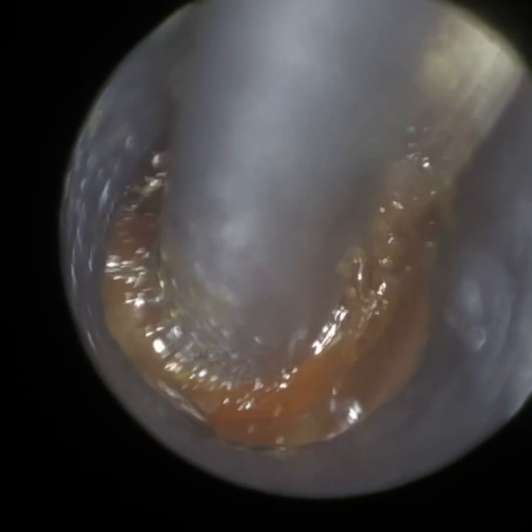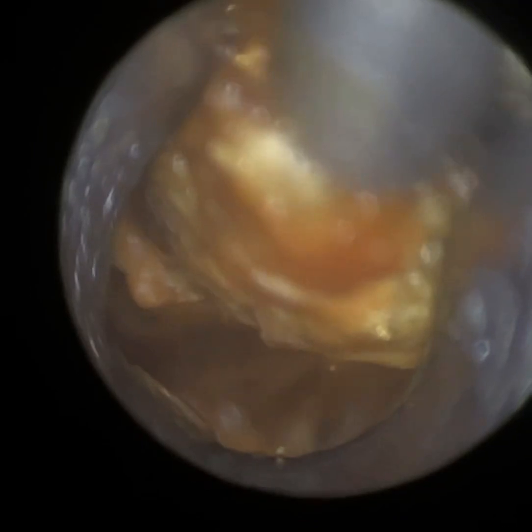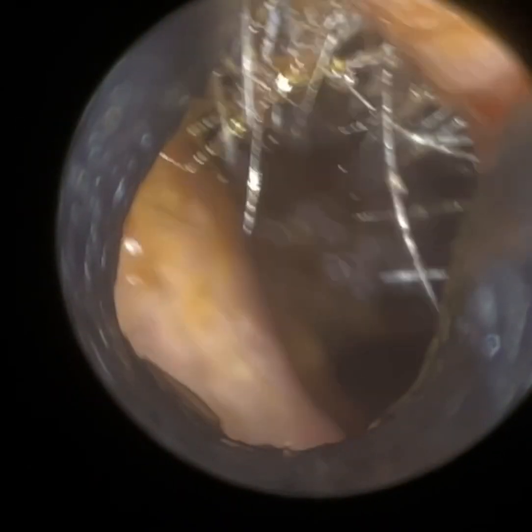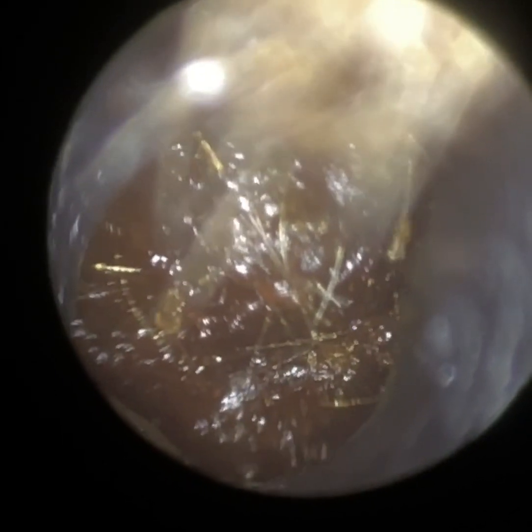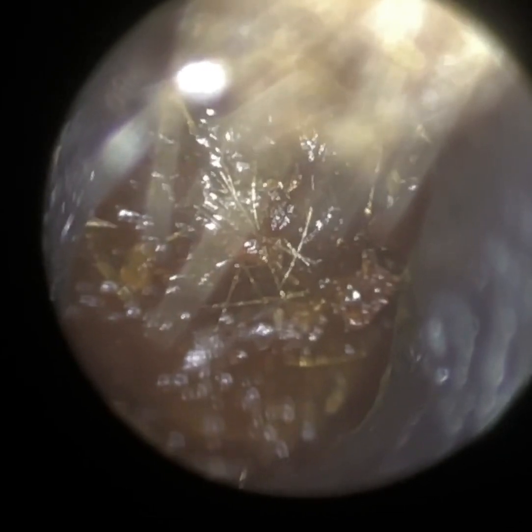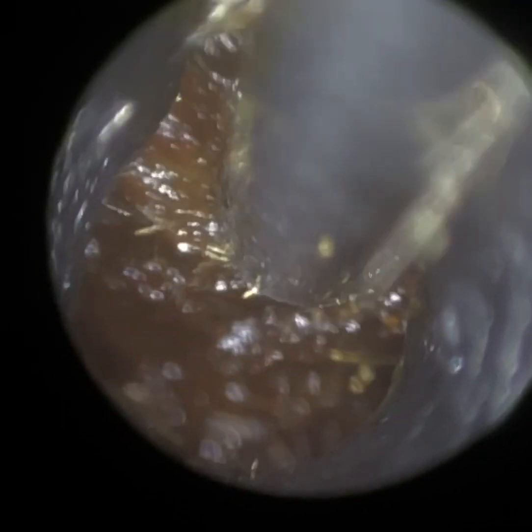We are using the 4.25mm specular here. There's also a smaller size — a 3.5mm — and then a couple of larger ones: a 5mm and a 5.75mm. You can see we're working our way towards the patient's eardrum, just getting the wax in focus. You can see how I'm using the sucker to move the hairs away as well. With an open slit, and even without, some patients' ears are very hairy and it can clutter the view, but you just use the sucker to move them out of the way.